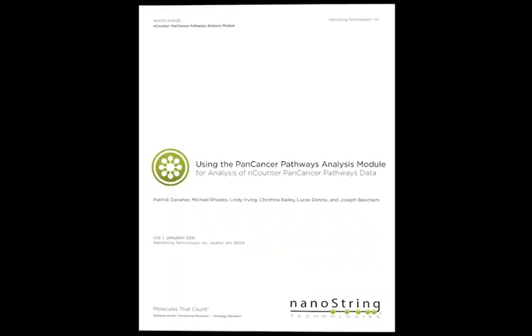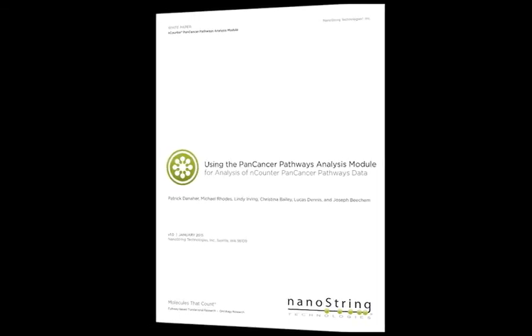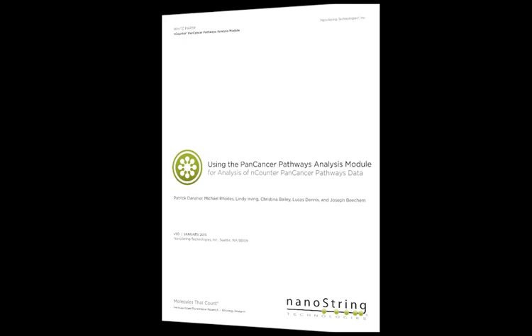Thanks for listening, and I hope this was useful. If you have any questions, the Pan-Cancer Pathways Analysis Module white paper contains even more detailed discussion of how to set up your analysis and how to interpret your results.